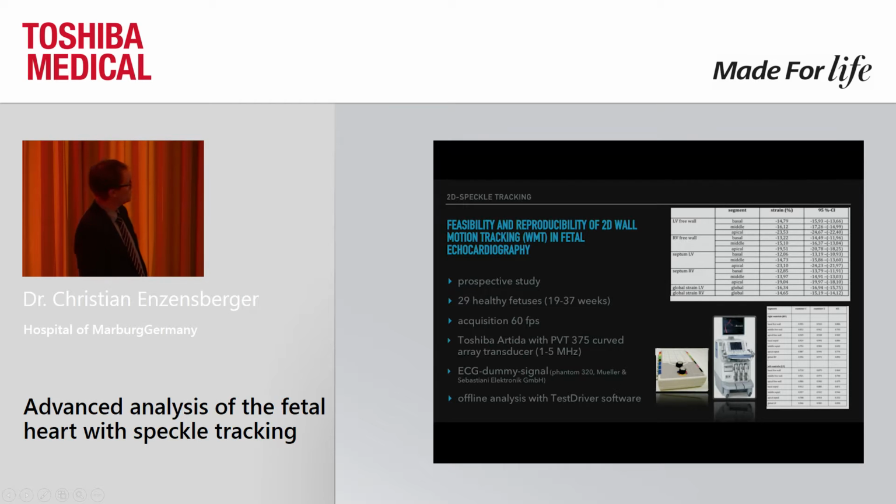What you can see in the upper right table is that we divided it into basal, middle, and apical segments, left, right, free wall, and septal, and finally the global longitudinal strain. All of this data is only the longitudinal strain.